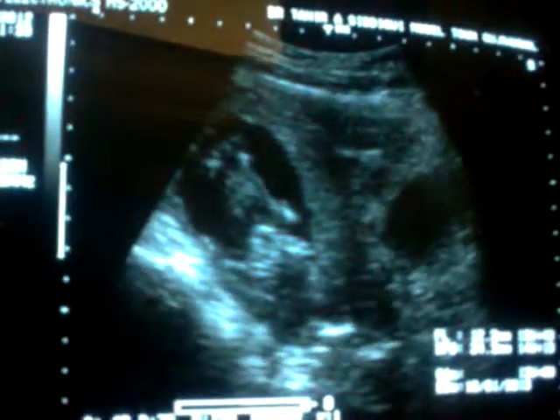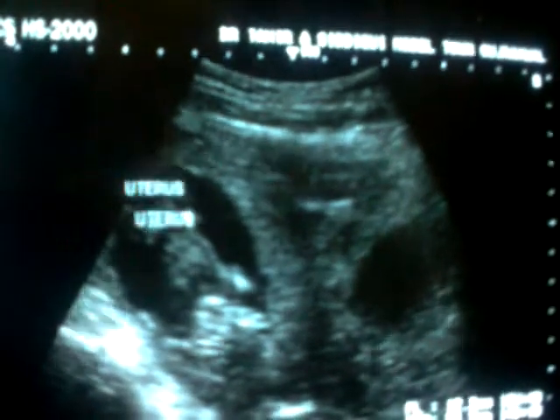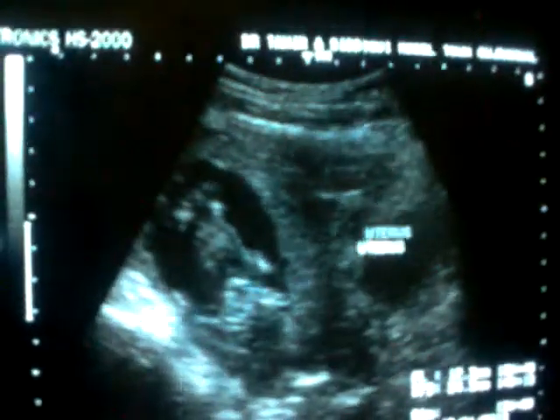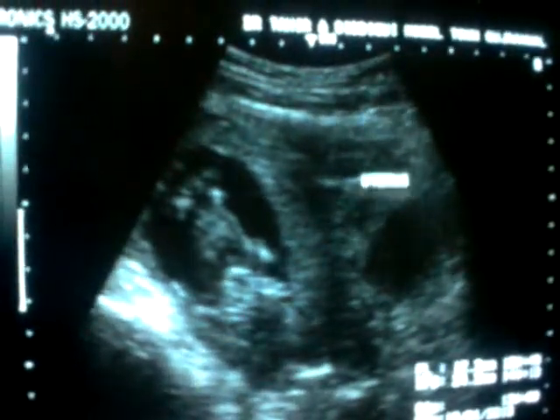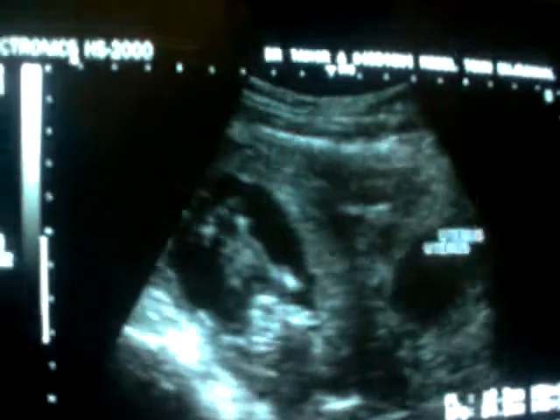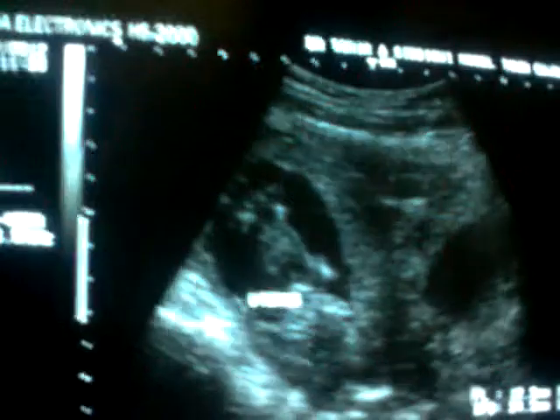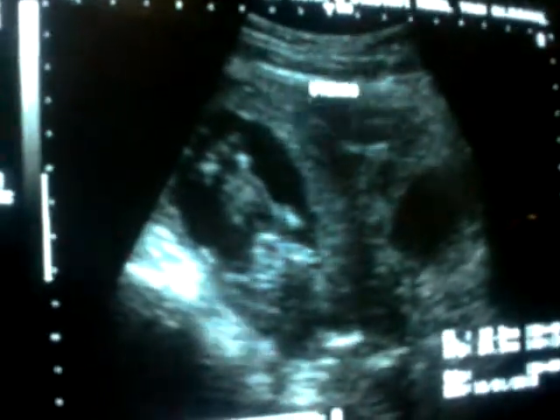Now this is again a review of the fact that this is the uterus, the myometrium. This all is the single uterus with two endometrial canals. One is empty, it has an empty gestational sac. This is suggestive of a resolving twin, with the second differential being an anembryonic pregnancy in the sac, that will only be of academic interest. Now there is a second sac with the fetus of 13 weeks 6 days.